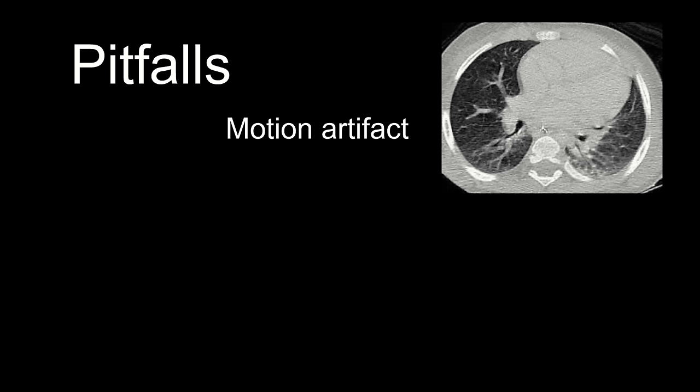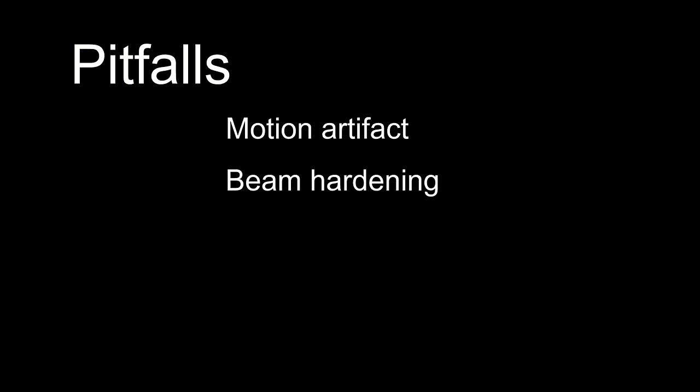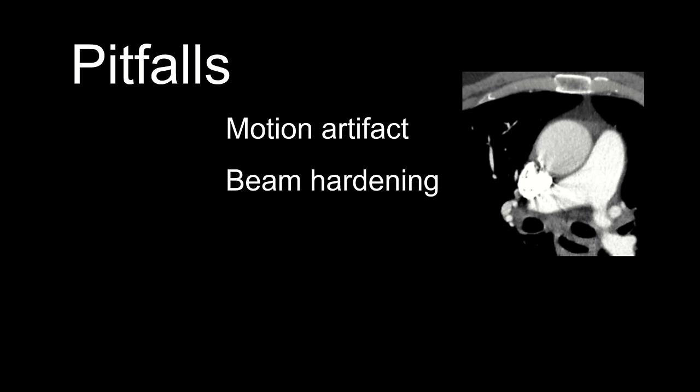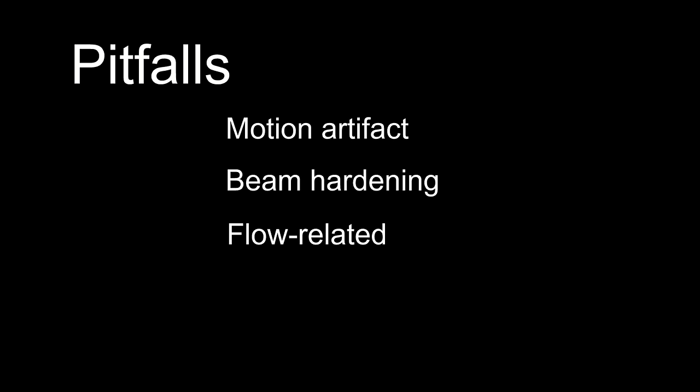There are a few common pitfalls that can lead to over-diagnosis of PE on CTPA. The most common is motion artifact — if you're questioning something small in segmental or subsegmental branches, switch to lung window and see if there's associated motion artifact in that region, especially at the lung bases. Beam hardening artifact from dense contrast can mimic PE in adjacent vessels, and there are flow-related artifacts from non-opacified blood from the IVC mixing with opacified blood.